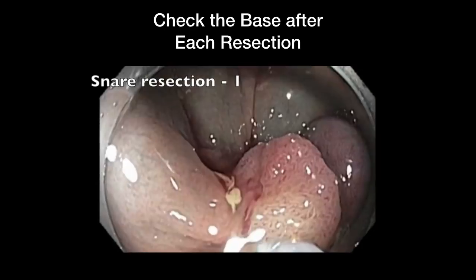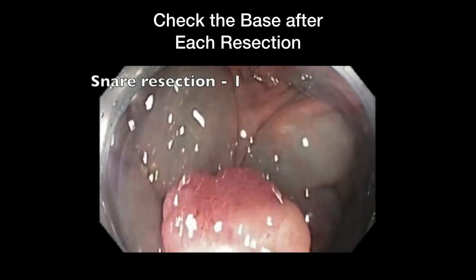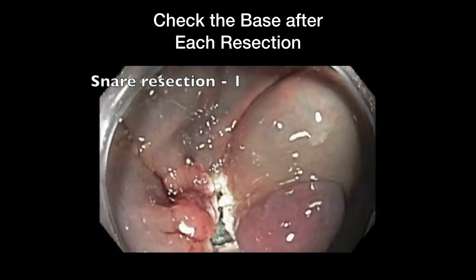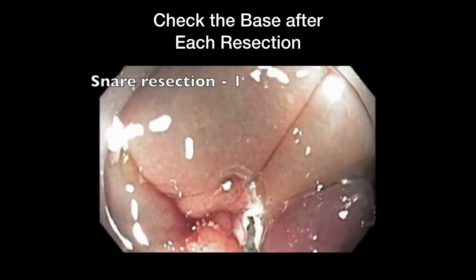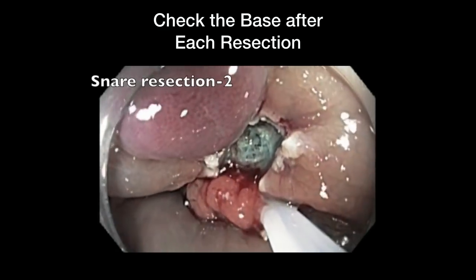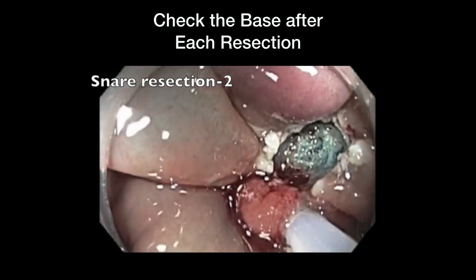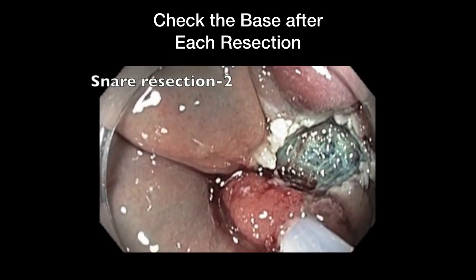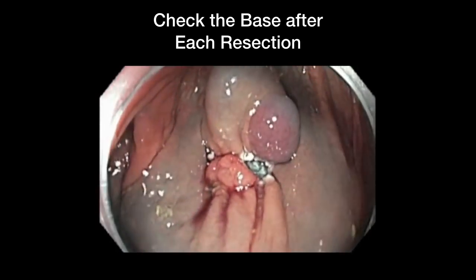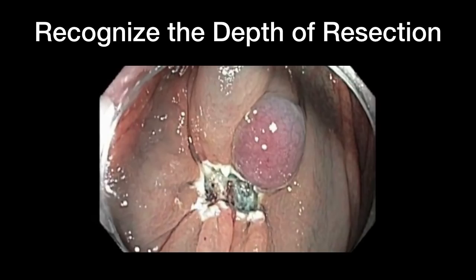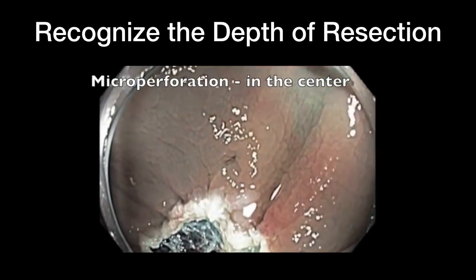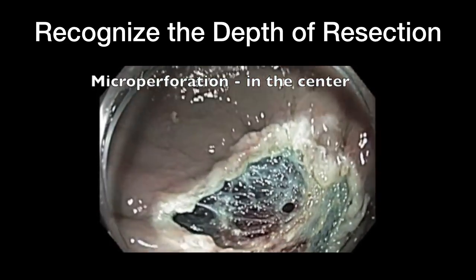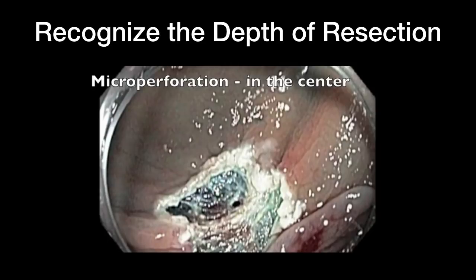We went ahead and did the resection using Endocut Q313. You should make it a habit after each resection to check if the base looks blue — that means it is limited to the submucosa. We completed the remaining half of the resection using Endocut Q313. After completion, we examined the base to define the depth of resection. An elegant study recently published in Gut from Michael Burke's group suggested that if you see blue, you should be happy — that is submucosa. If you see anything white in the center, that means there is muscular injury or scar tissue. And obviously, if there's a hole, you can identify it in the center.